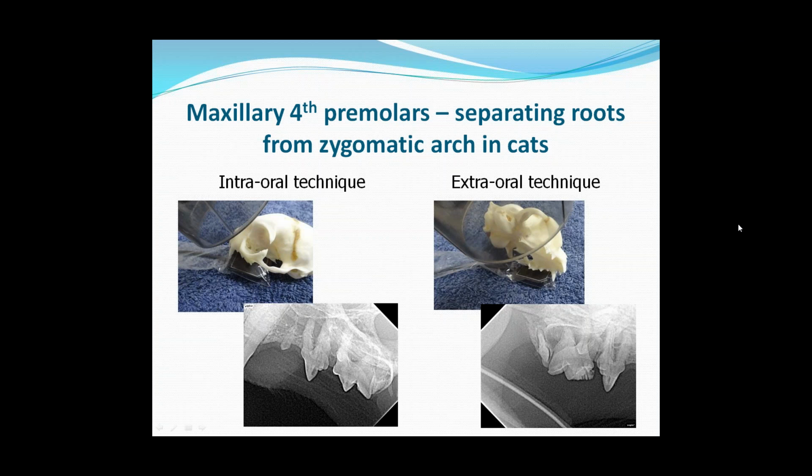We take 6 to 7 radiographs in order to get a full mouth in a cat. We'll take the mandible, we'll get both canines and all incisors on one film, and we'll get both premolars and a molar on another film, left and right, so there's 3. We'll then take both the extraorals and get, as you can see here, 2 or 3 premolars and a molar on the left and right, so that's another 2, so now up to 5.